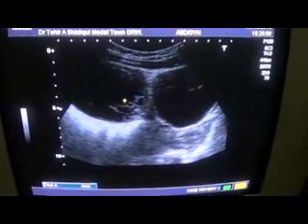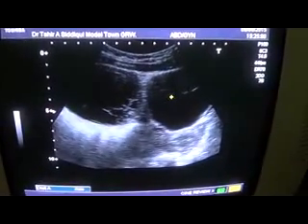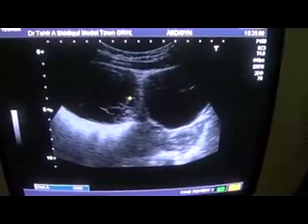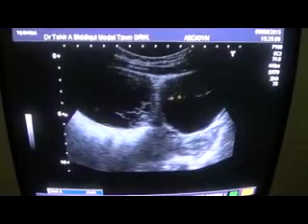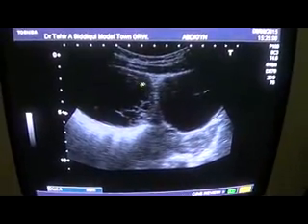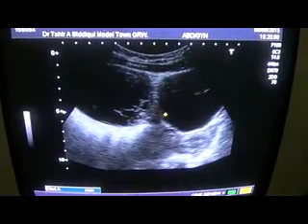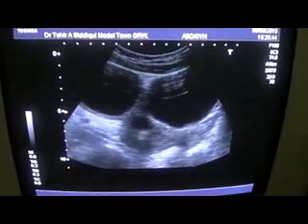If this contains septa, suppose we don't see septa, it's a clear cyst, then which one will be the urinary bladder, or both are cysts? How will we come to know? You ask the patient to micturate, and whichever is the urinary bladder will disappear, provided there is no urinary bladder pathology. Now this is the urinary bladder in this patient, and this is the cyst, the pathology, with numerous internal thin and thick septa.